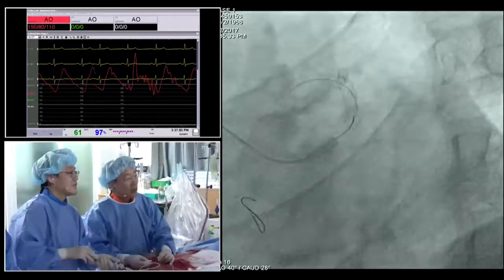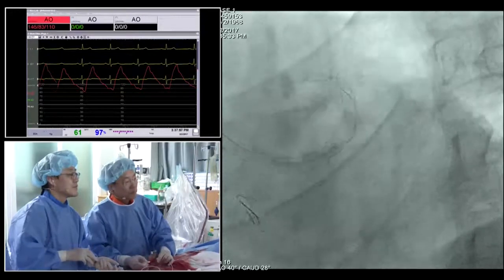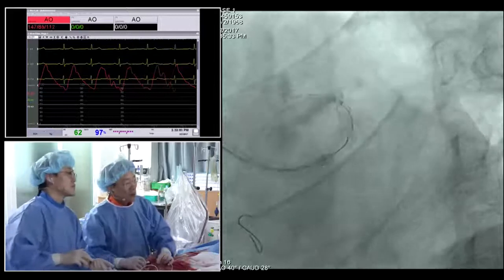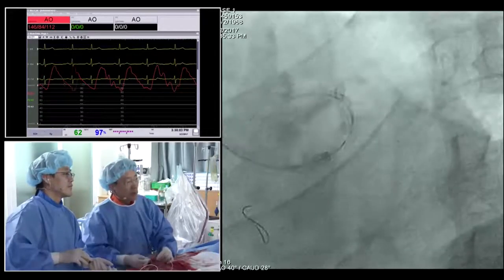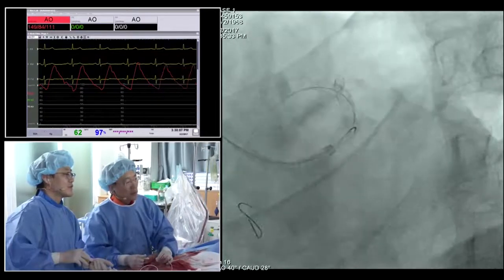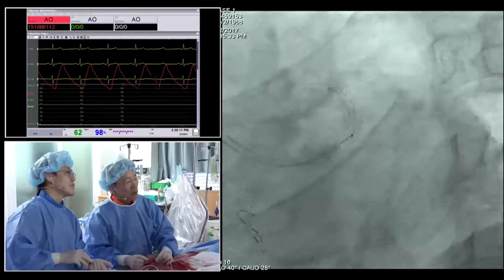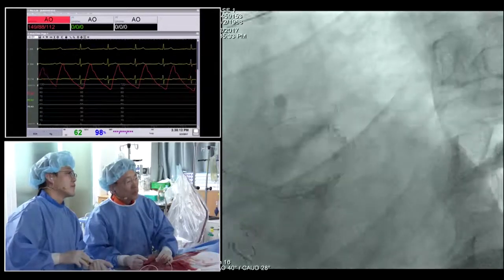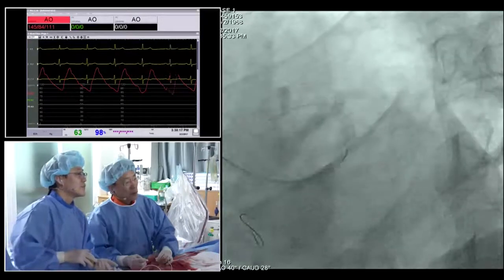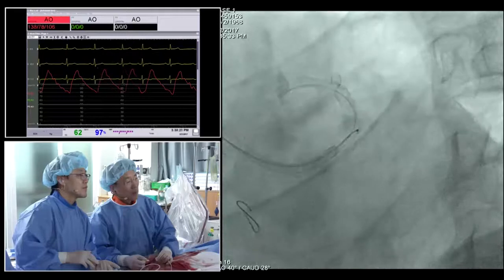Thank you for that. I think it'll just take time. However, it's not a big deal. Rewiring for the circumflex. If it doesn't work, we need another balloon. You are giving us some consolation. We also need another high pressure balloon. We also struggle to get in sometimes. So it happens with you also.